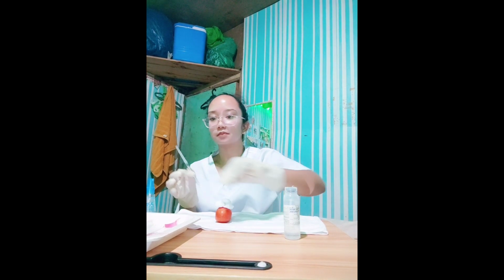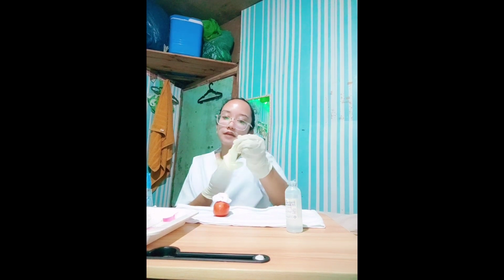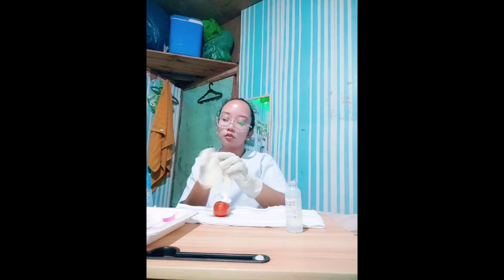So we will discard the uncapped needle and syringe in a safe receptacle to prevent accidental needle stick injury. Now we will remove our gloves, and after this we will wash our hands and we will document all relevant information.